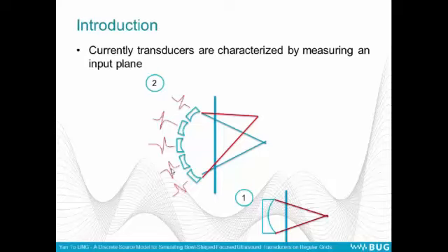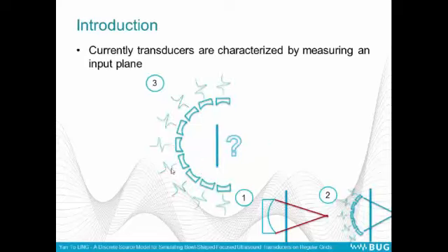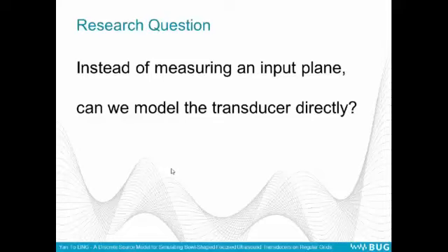In the third case here, we have a transcranial ultrasound transducer. In this case, it is not possible to measure any input plane for the model. So the research question is: instead of measuring an input plane, can we model the transducer directly?